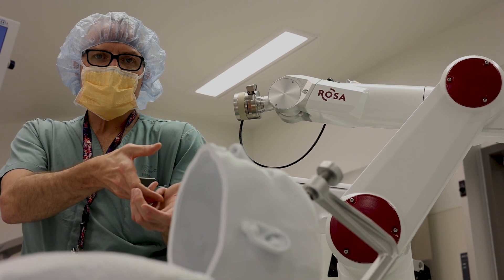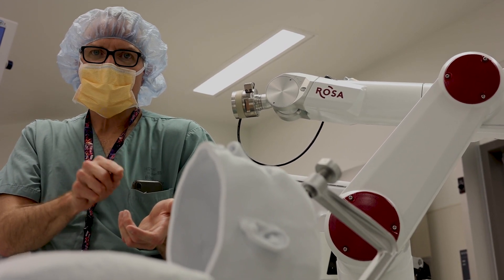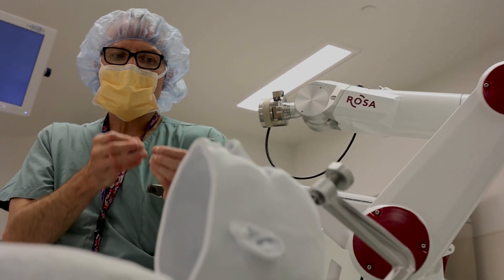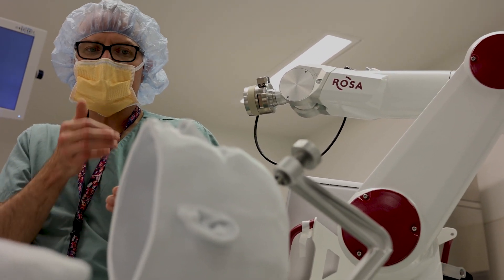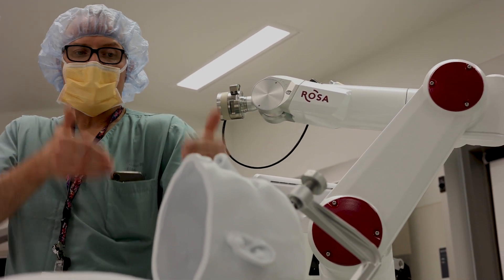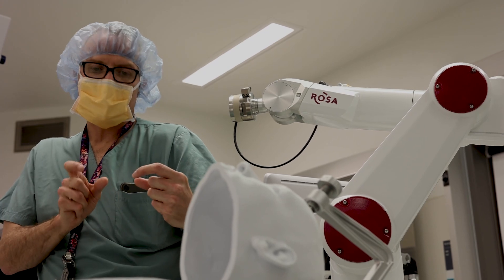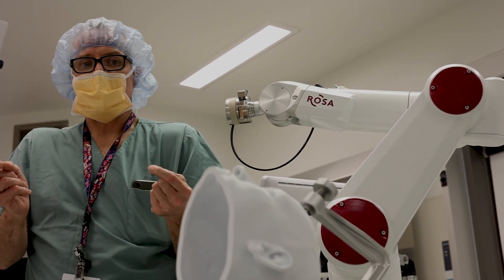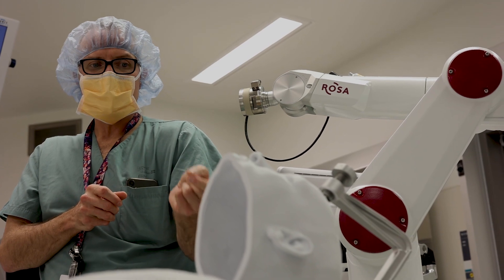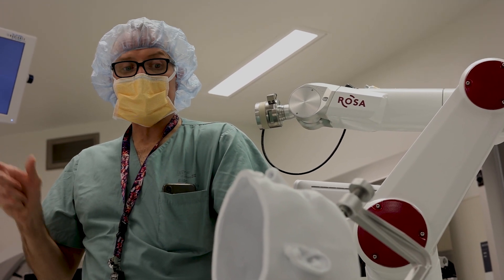We take Rosa's arm back to a point where we start seeing the first threads on the anchoring bolt. Rosa knows the distance from that point to the target on the trajectory that I've made. We also know the length of the adapter of Rosa's arm, so we basically do a subtraction. Once we have that number from the subtraction, we get Rosa's arm out of the way — but we still have the anchoring bolt, which is now the stereotactic device.